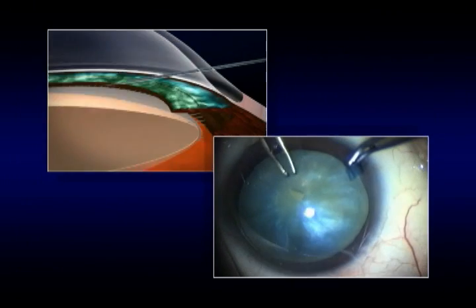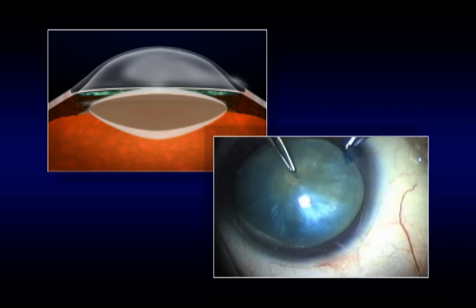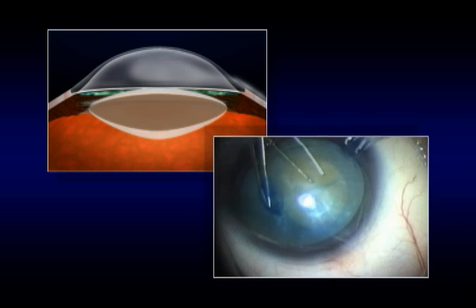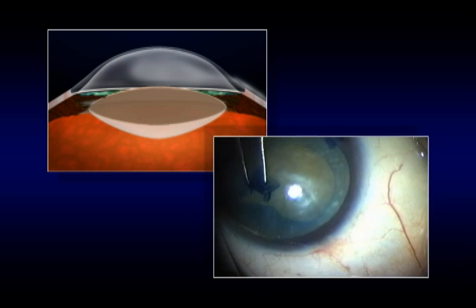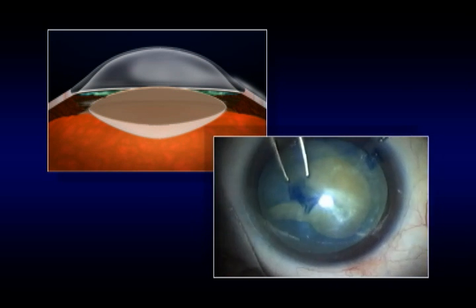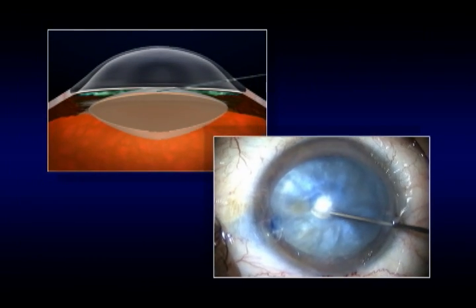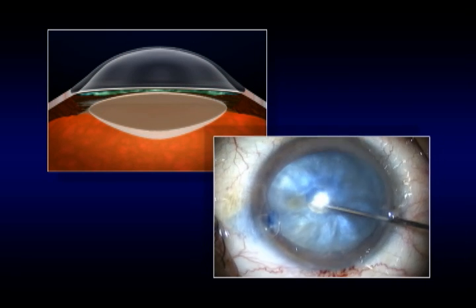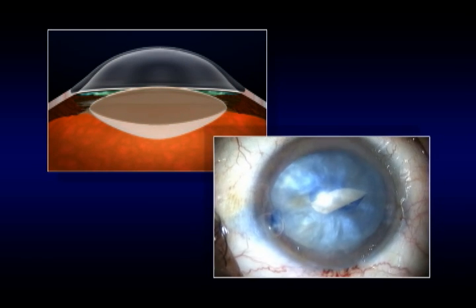In this first case, we punctured the capsule and did not do the posterior voiding. With the decrease of the pressure in the anterior chamber as some visco exits the eye, the posterior pressure pushed the nucleus upwards, and when the opening picked up the zonular direction, the capsule teared. In this second case, the sucking of the interior liquid with the cannula caused a pressure decrease in the area just anterior to the nucleus. The posterior pressure pushed the nucleus upwards, and the flag appeared.